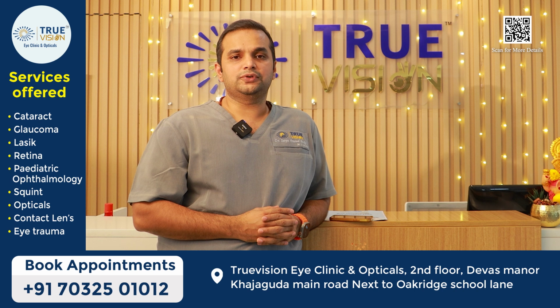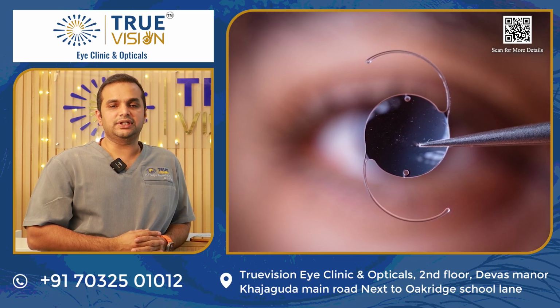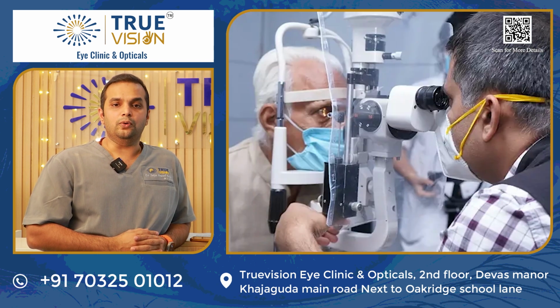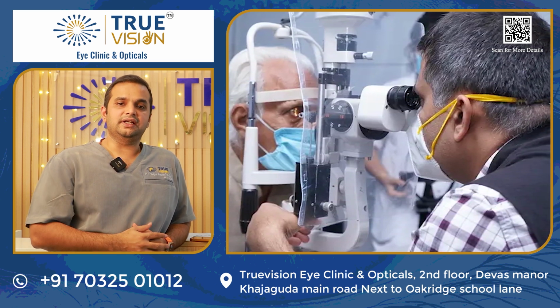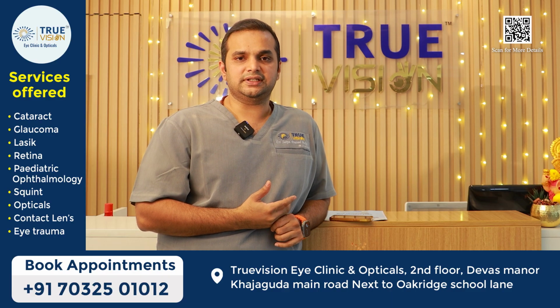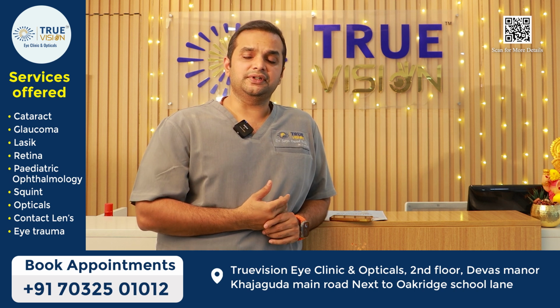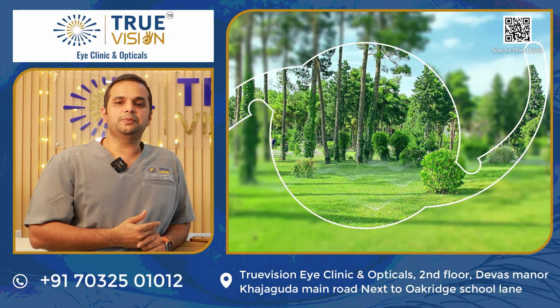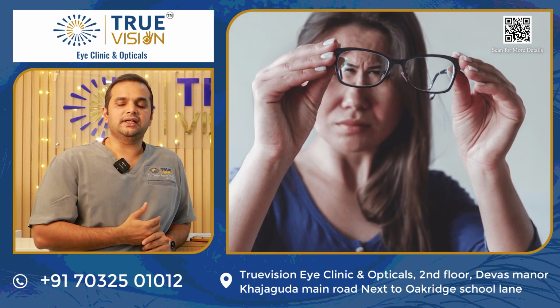First and foremost, the most common type of lens being used is called a monofocal lens. Now, a monofocal lens is usually preferred for patients who have a sedentary and retired life, the older age group, and who have some systemic conditions which have affected the retina or the nervous system of the eye, namely diabetes, hypertension, etc. If the nervous system or the retina of your eye is damaged, your doctor would usually prefer a monofocal lens. Now, in a monofocal lens, your distant vision would be corrected up to 95%, but for your near vision, you will be requiring glasses.